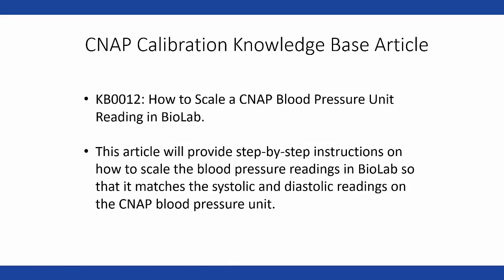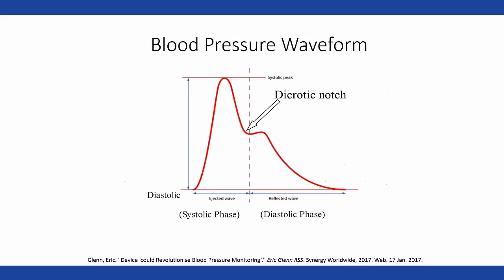Okay, and if anybody had any additional questions on the CNAP, this is an article that we've already created, knowledge base article number 12. You guys can find that on our knowledge base website, which is support.mindwaretech.com. And this will show you, just like it says, some step-by-step instructions on how to scale your blood pressure monitor with BioLab.